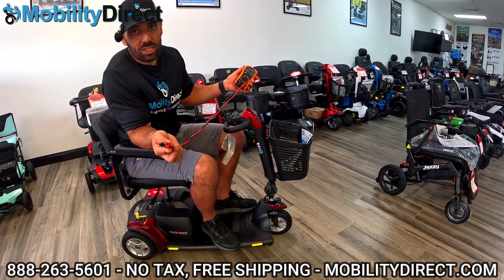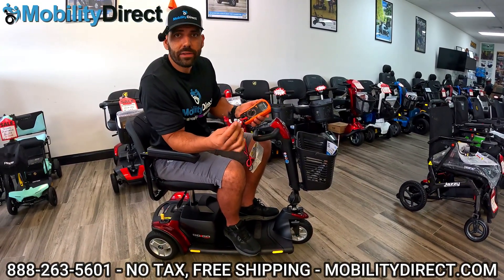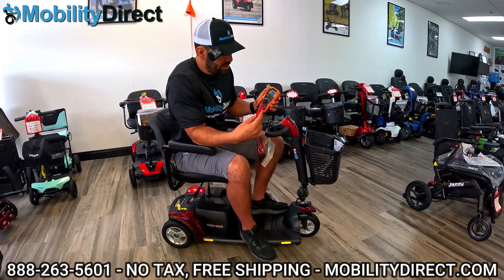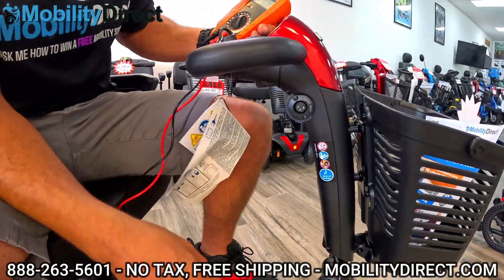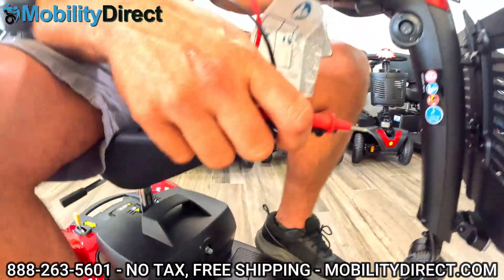Your scooter may have a detachable battery pack or it may not. Your scooter might have lead acid batteries or lithium. Either way, this is going to work. Take your positive and your negative probe and find your charging port. This scooter has two charging ports — one here and one on the removable battery pack as well. Just to keep it easy, I'm going to use the charging port up high.